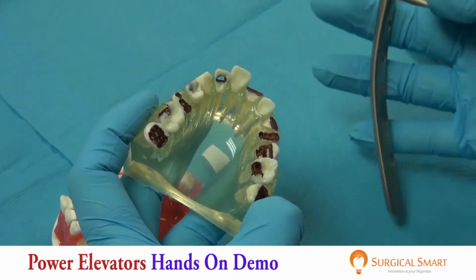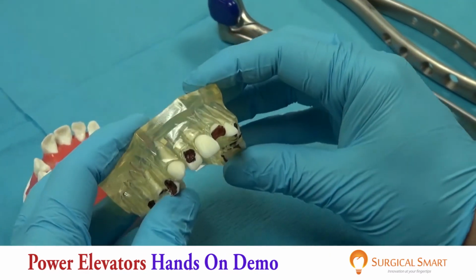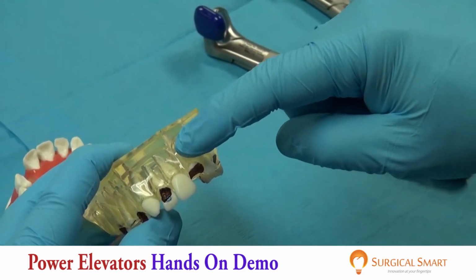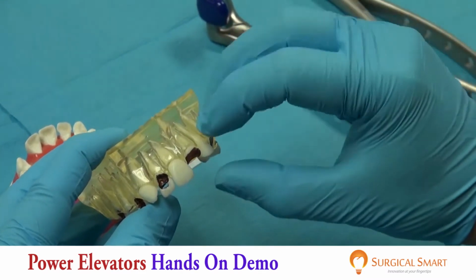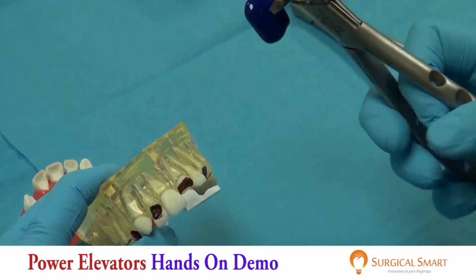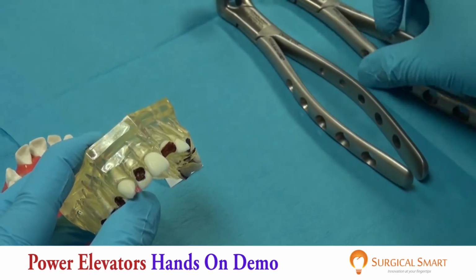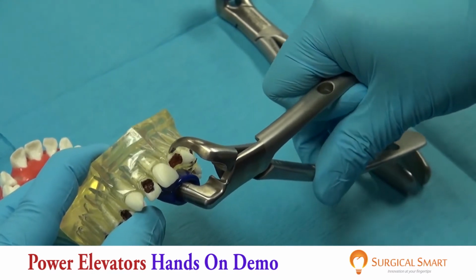It also applies to anterior teeth. So for example, the very common one is you have a patient who comes and sees you and they have a fractured central incisor, and you want to take it out. Now with the physics forceps before, you would put the bumper on the labial aspect and you would lever it out. However, because the fulcrum is on the buccal plate, very often the buccal plate will break. The beautiful thing about this is that you can do exactly the same thing as the physics forceps. You can lever it toward the buccal, but here's the beautiful thing. You can also use the other forceps and you can lever it toward the palate, like so.